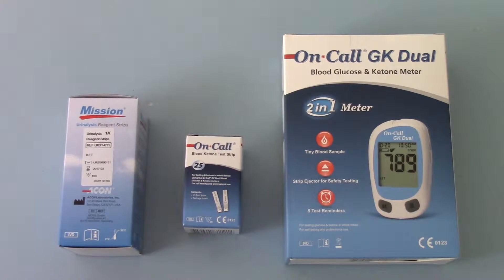Welcome to this product demonstration video where we're going to talk to you about your options for testing ketone levels. There are two reasons people commonly want to determine their ketone levels or ketone status. The commonest reason is with diabetic patients who are monitoring their control and want to be certain that they're not running into ketoacidosis.